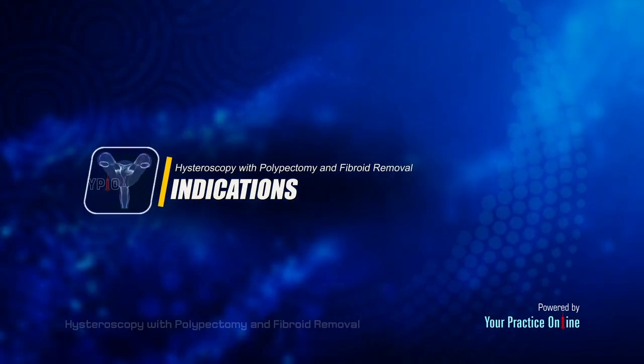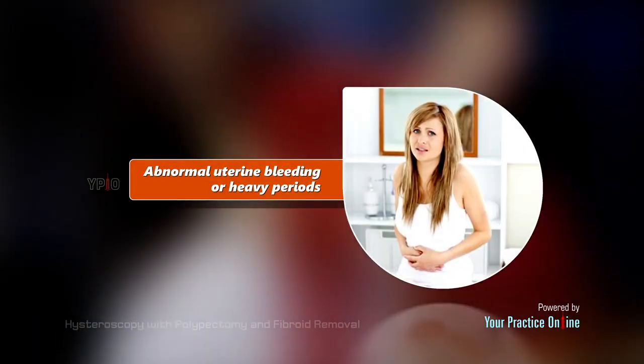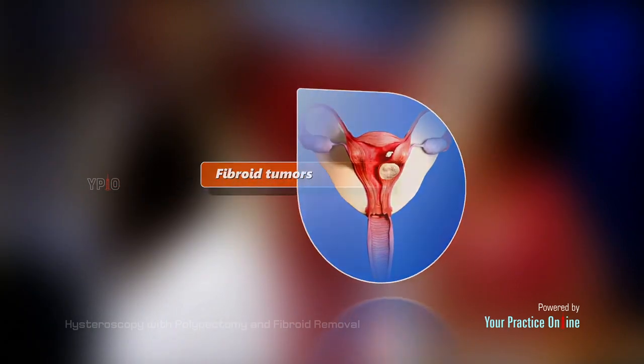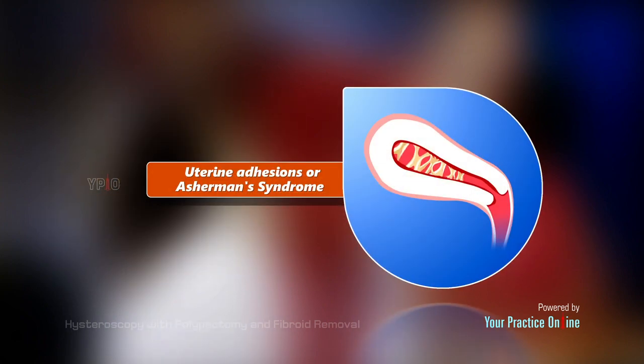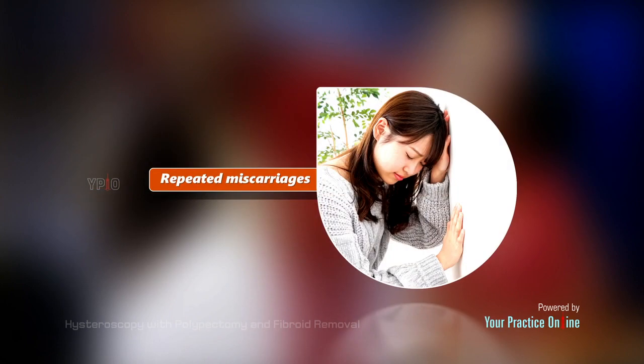Indications. Hysteroscopy with polypectomy and fibroid removal is indicated for abnormal uterine bleeding or heavy periods, fibroid tumors, polyps, chronic abdominal pain, uterine adhesions or Asherman's syndrome, repeated miscarriages, infertility.